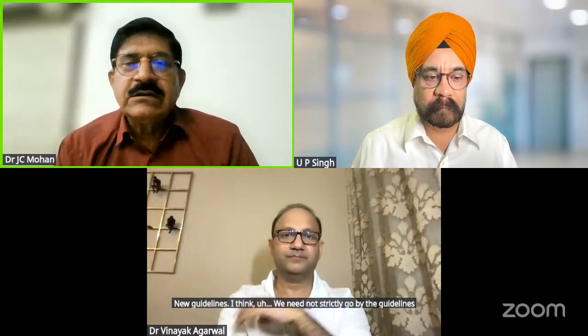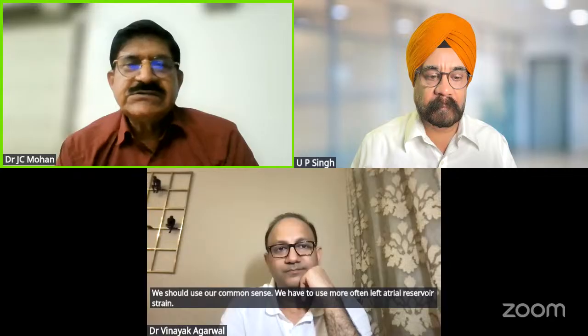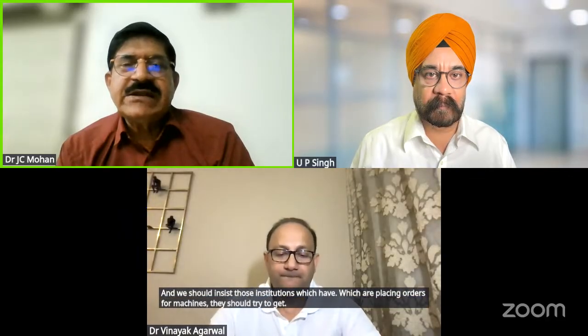Singh, for organizing this excellent webinar on diastology new guidelines. I think we need not strictly go by the guidelines in toto. We should use our common sense. We have to use more often left atrial reservoir strain, and we should insist those institutions which are placing orders for machines, they should try to get machines which have dedicated software for left atrial reservoir strain.